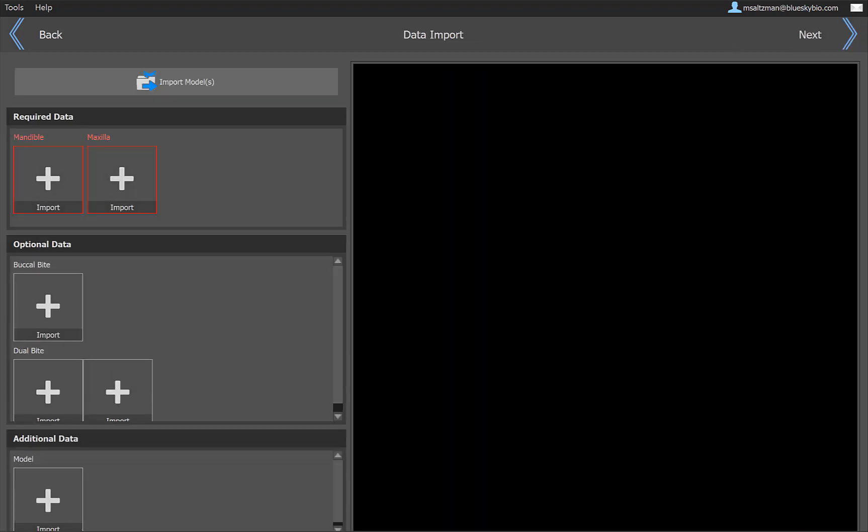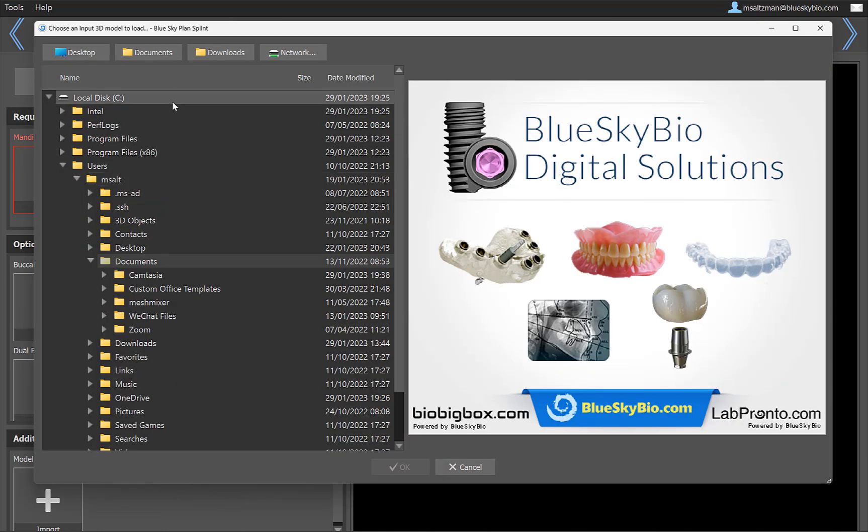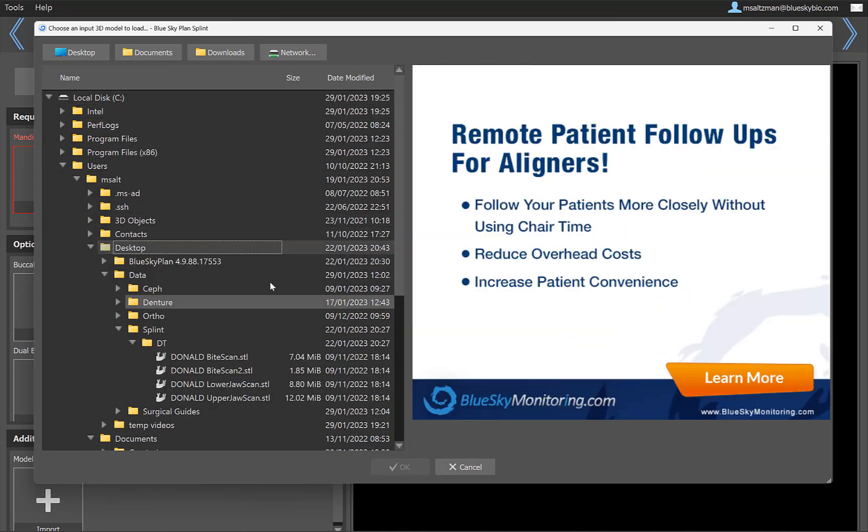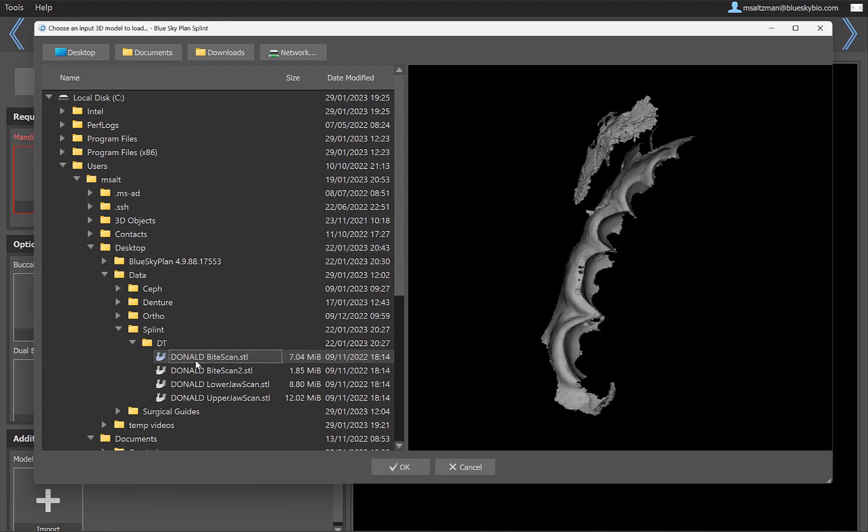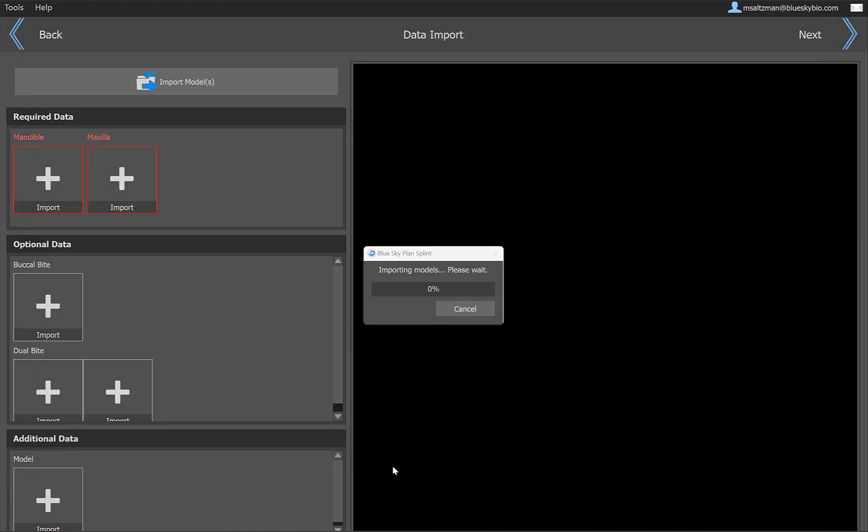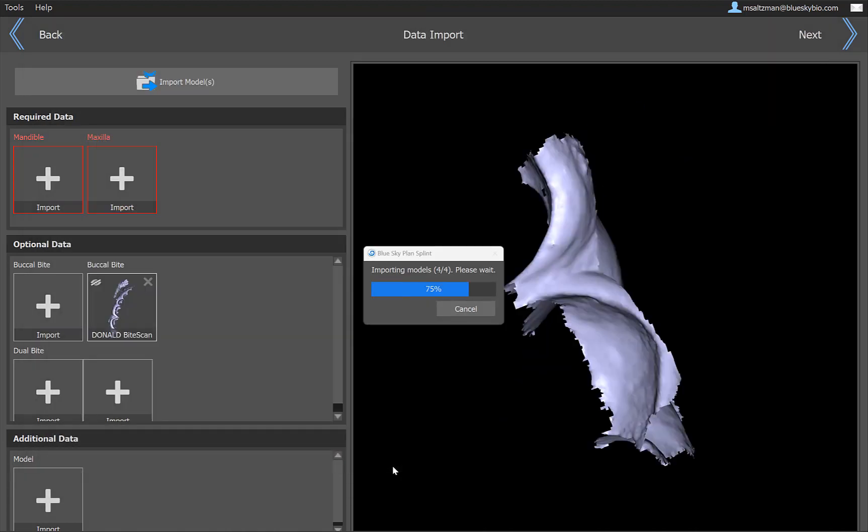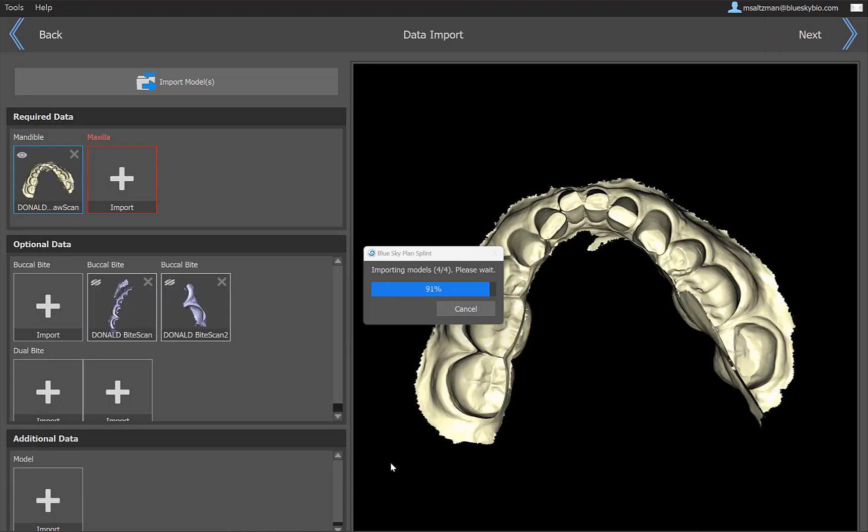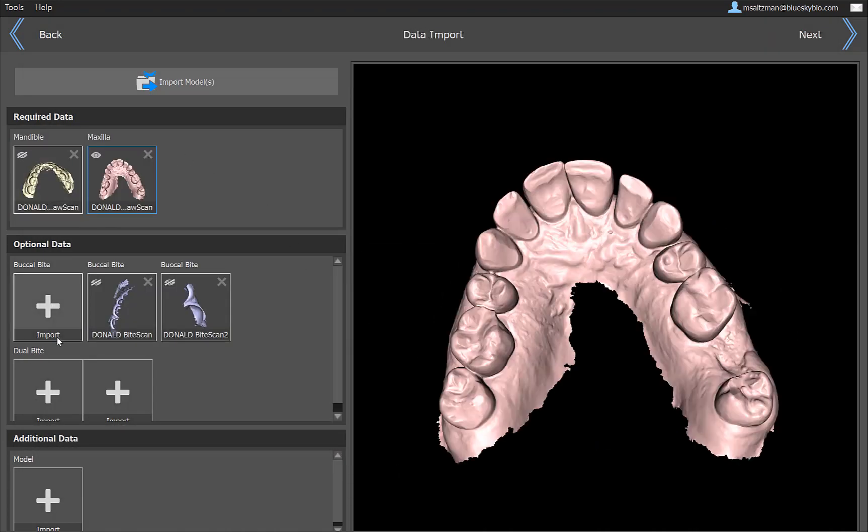What we see now is our improved data import screen. This will help organize information better. The best way to deal with this is just to go to import models and go ahead and navigate. Navigate to the relevant STL files or OBJ files. You could multi-select by holding down the shift key and the left mouse button, and then go ahead and clicking on OK. Now the software will automatically organize the relevant information.